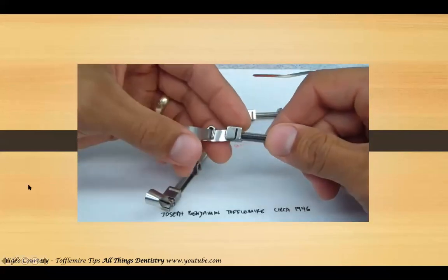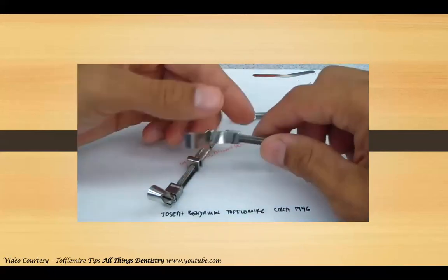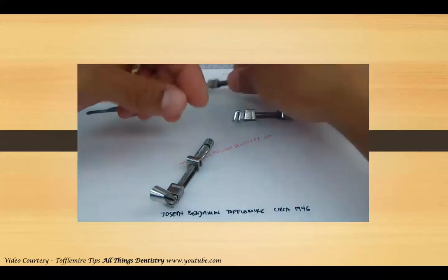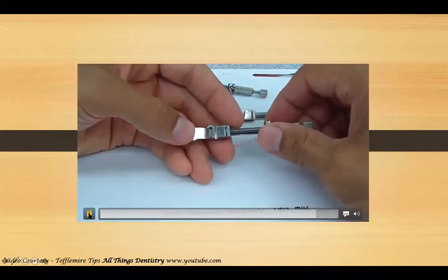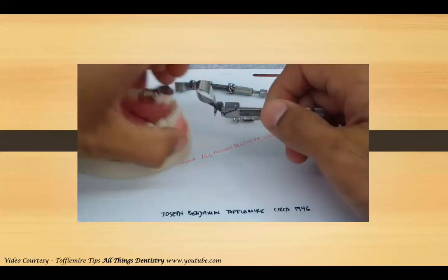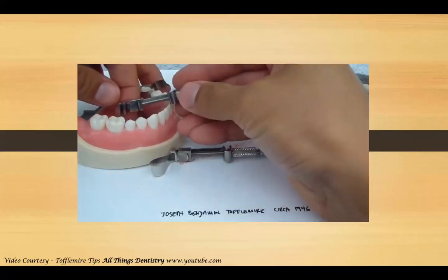That would seem insignificant, but when you're trying to crank this down and tighten it around a tooth intraorally, and it starts to slip, and it always wants to slip that way, it becomes extremely frustrating compared to the appropriate Tofflemire that is flush. And again, this cannot be placed. It's really difficult to place this lingually. But if you do have the contra angle.